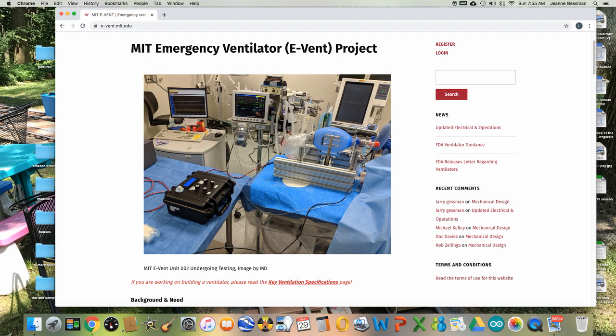The MIT design compresses an Ambu bag with mechanical hands. This is an elegant design, but the mechanical mechanism is a bit complicated perhaps to manufacture. So this video is going to discuss alternate designs using a linear actuator.